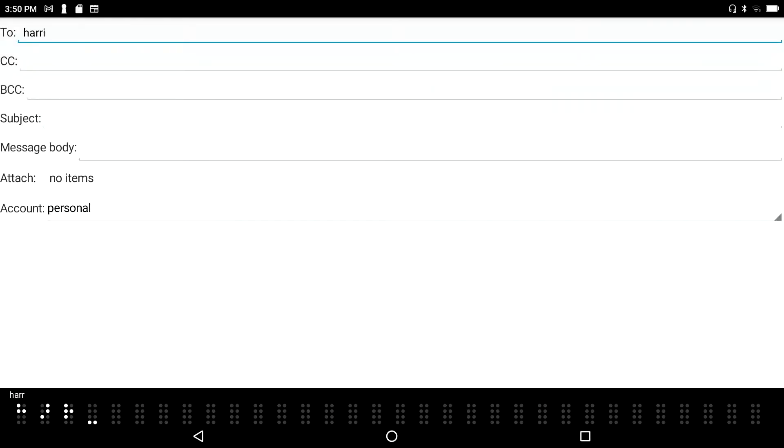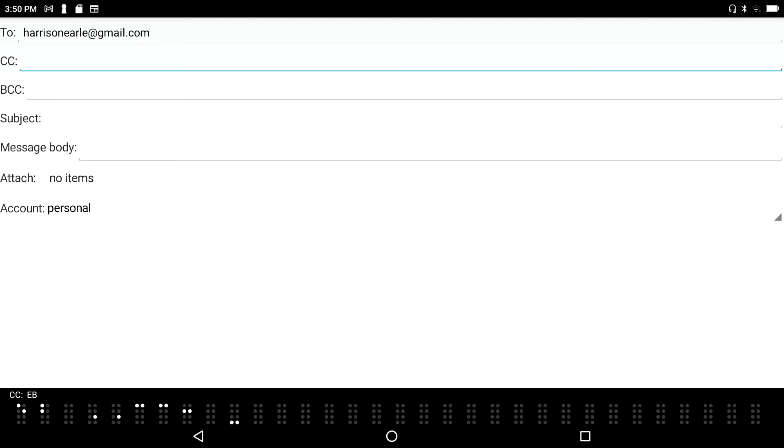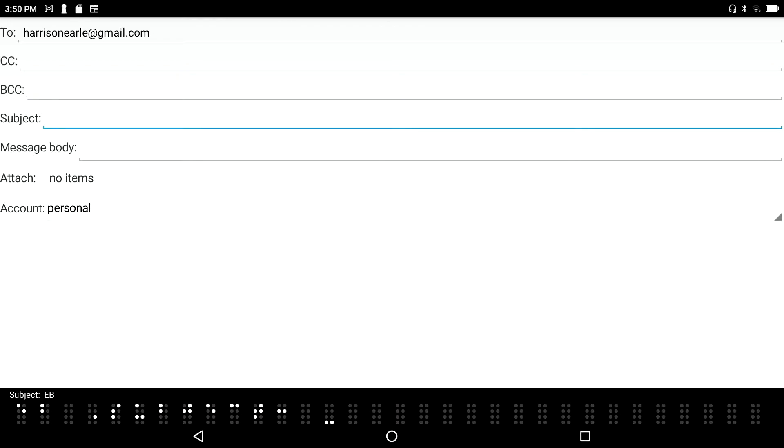H-A-R-R-I-S-O-N-E-A-R-L-E dot G-M-A-I-L dot C-O-M. I'm going to tab to the subject field. That's the CC and the BCC fields and type in one-hand mode document.